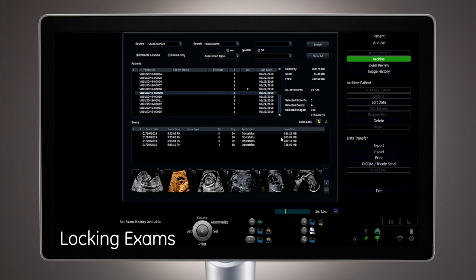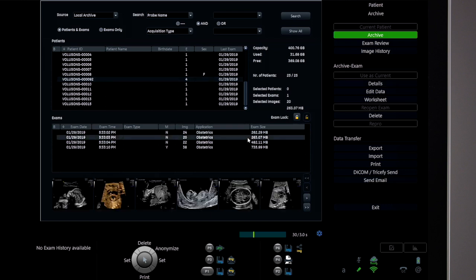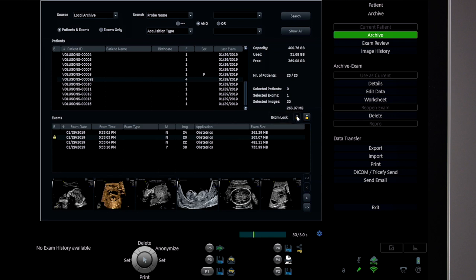Exams can be locked to prevent them from being deleted from the archive. To lock an exam, click the exam and then click the Lock icon. When deleting the archive, any locked exams will remain. Click the Unlock icon to unlock the exam.